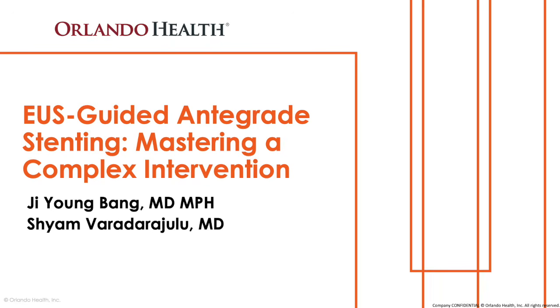EUS-guided antegrade stenting is one of the most technically demanding procedures in interventional endoscopy and carries a significant risk of adverse events, including bile leak and perforation. In this Florida Live educational video, we demonstrate a systematic, step-by-step approach highlighting the critical technical principles and decision-making strategies required to maximize safety and optimize clinical outcomes.